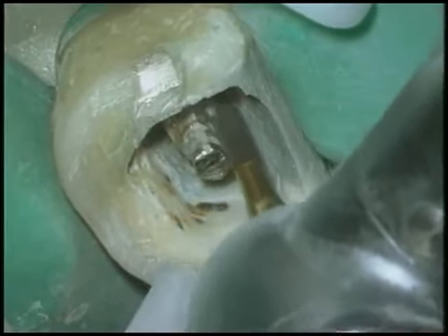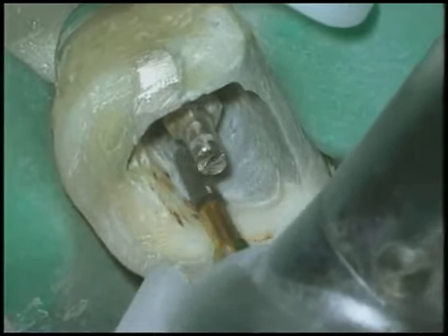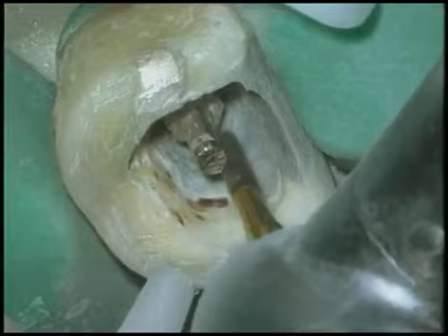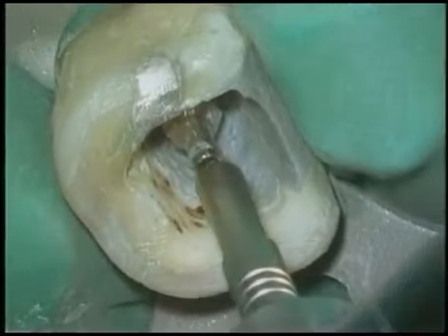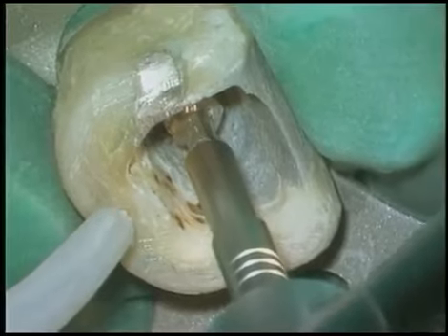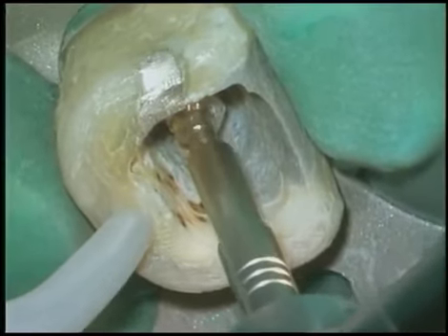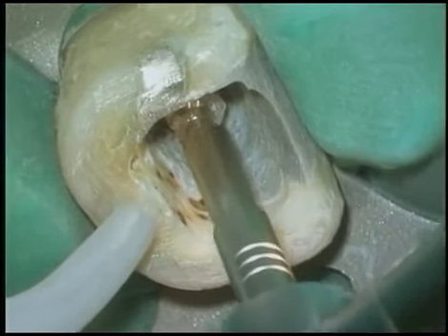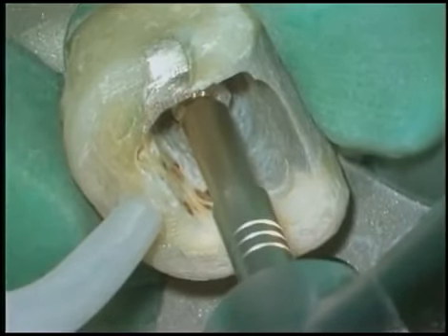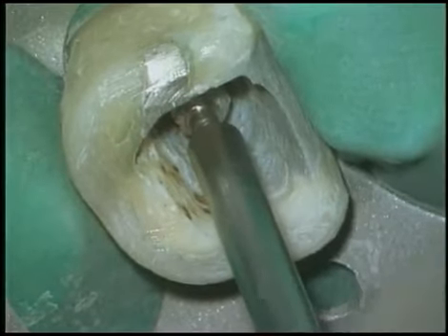Notice as we work around the post, metal to metal, we're very steady. Use your offhand, the thumb, and support the head of the handpiece. The machined down post now can receive the appropriately sized trephine. Use a slow speed, high torque handpiece. In kind of a pumping action, we can very easily now mill down the reduced post and make it very round.